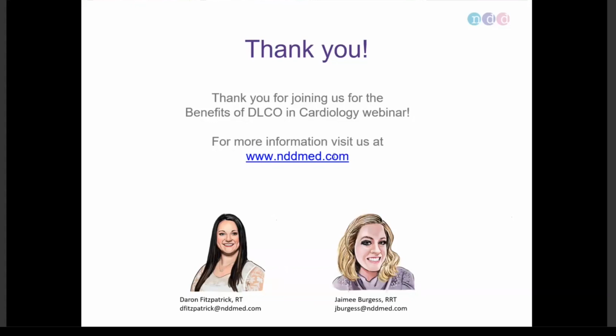My watch just froze. Is there a relationship between DLCO values and mortality? Those papers that Jamie posted, when it comes to using it, especially for pulmonary disease or heart failure with low ejection fraction, there's definitely a correlation with that. You can grab those links. But yes, there is.